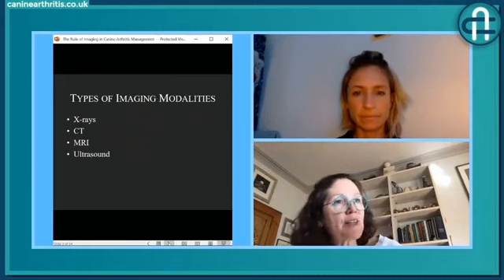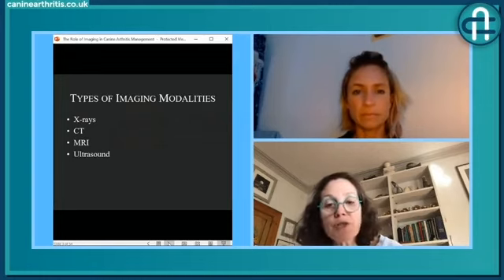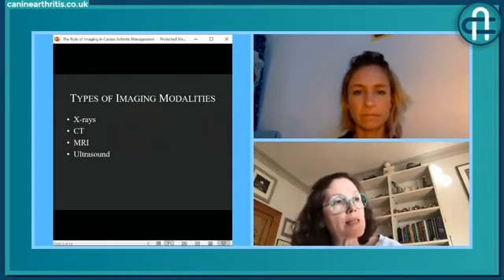What you will tend to find is how they work is that the X-rays, as they pass through the body, make the screen or the cassette, the image, look black. So the more that come through, it'll be blacker. The fewer that come through, it'll be white. So bone is white, lung is black. And that's what you'll tend to see when you see your dog's X-rays on the screen. You'll see that the bone looks really quite white.